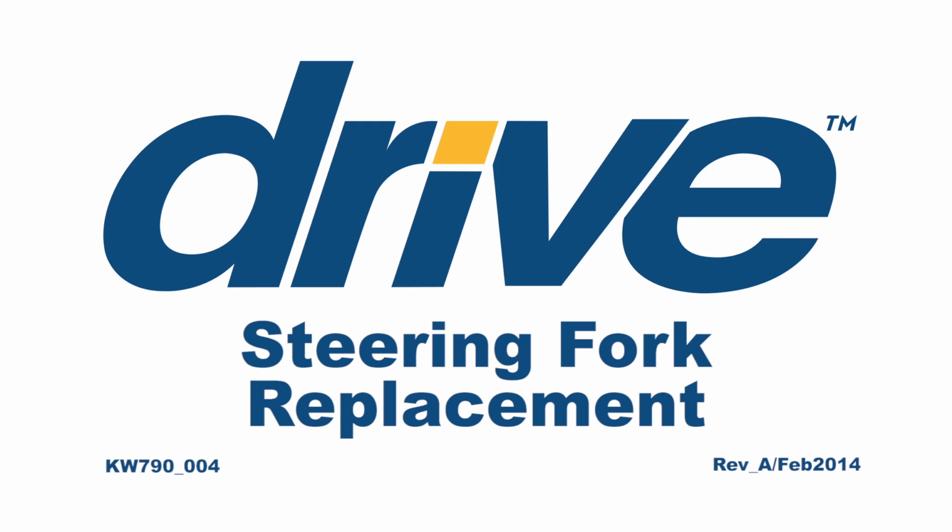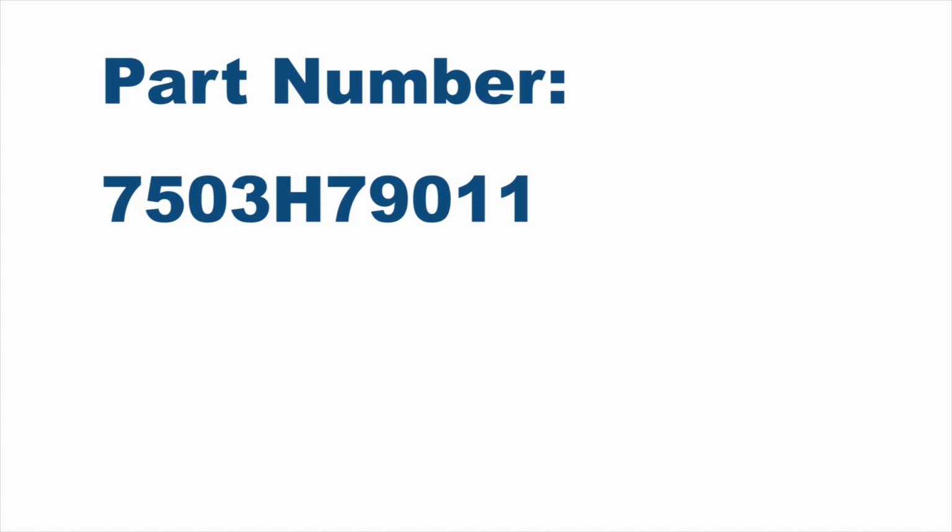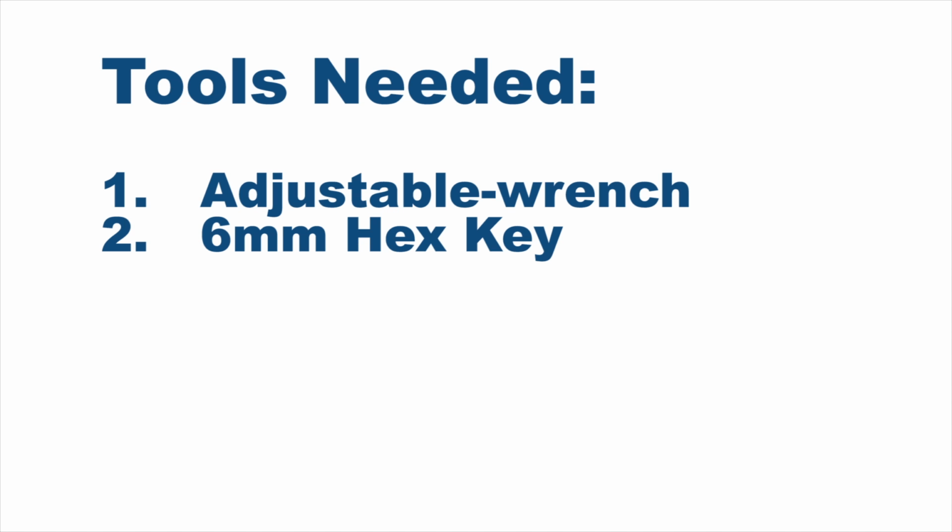Drive Medical Knee Walker 790 Steering Fork Replacement Video. Tools needed: adjustable wrench, 6mm hex key.